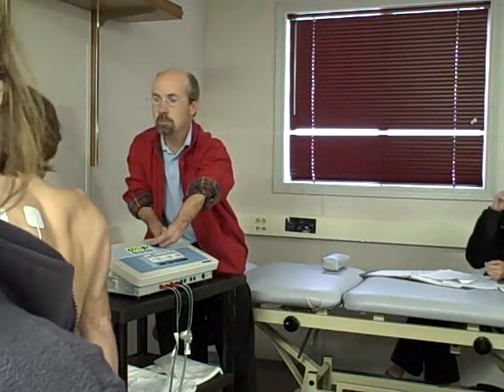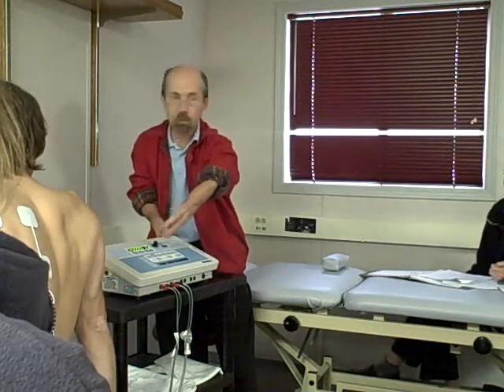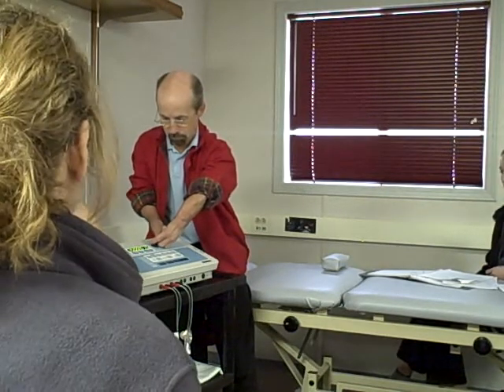No, I just very gently. That's what I do with my patients. I'm not telling you we need to, but could you handle more? The current comes through, and then you know it's on. You get that nice validating sensation.